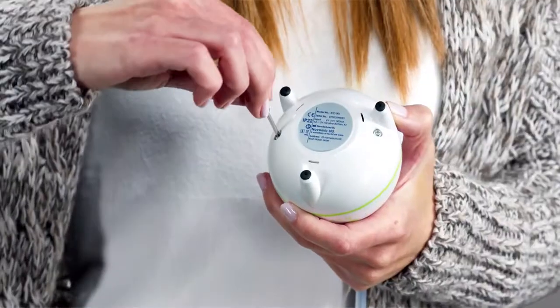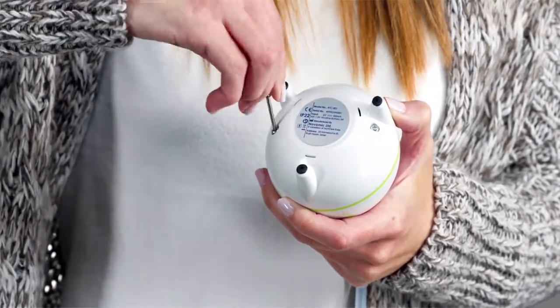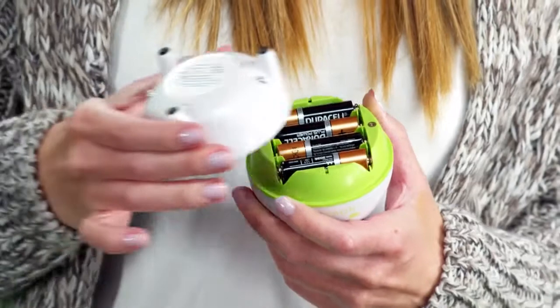Before using the device, open the battery compartment located at the bottom of the device with the screwdriver supplied in the kit. Then insert four batteries.